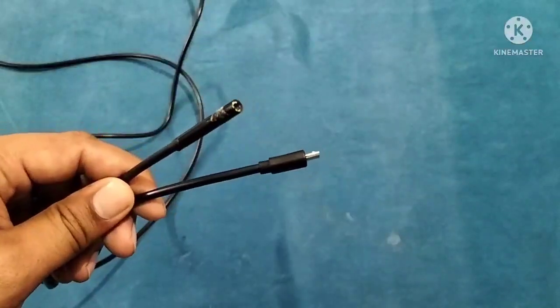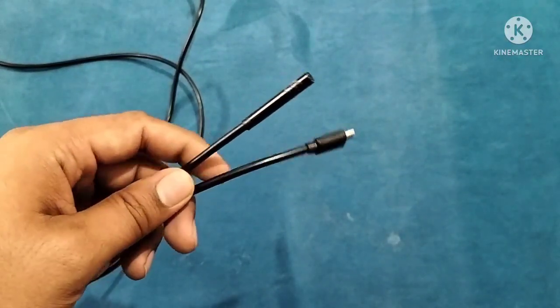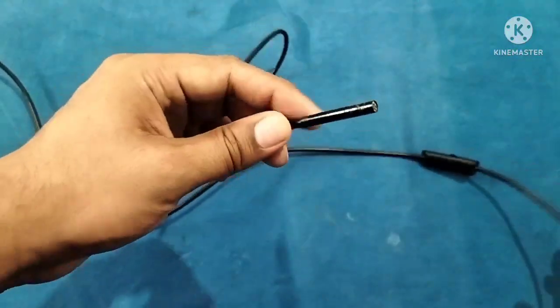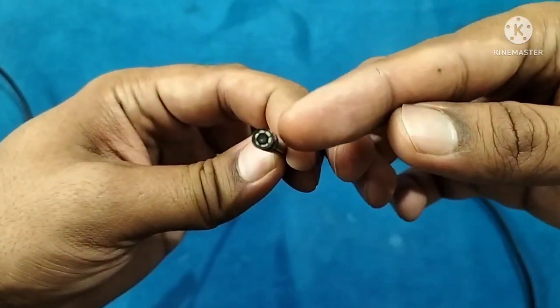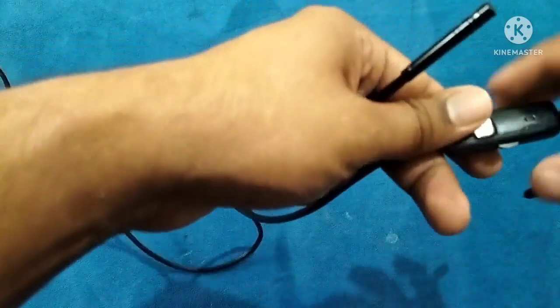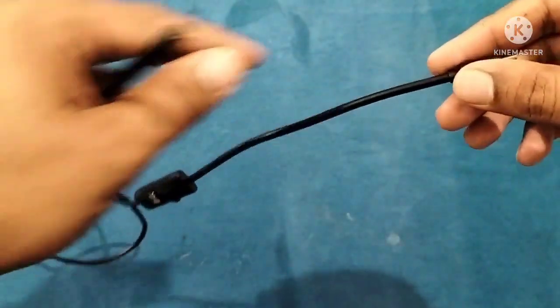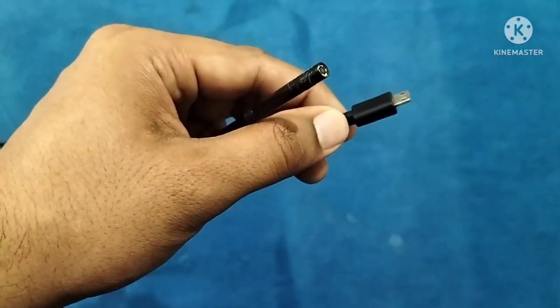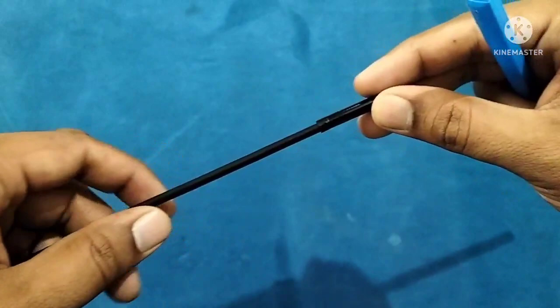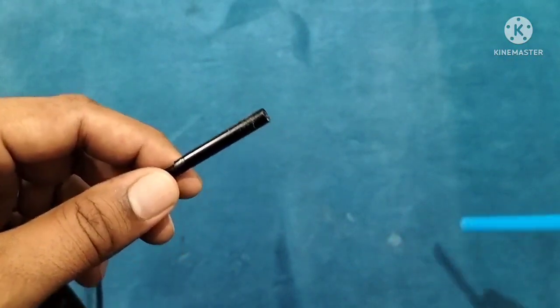This is a snake camera or endoscope camera which is available on Amazon. It can be used with Android phones. The wire is pretty large, making it easier to use. At one end there is a camera along with a row of LEDs which helps in illuminating the dark chambers of the box. There is an LED regulator which regulates the intensity of light, and the other end is connected to the mobile. The arthroscope used in arthroscopy comes under the category of rigid scope, but the camera we are using here is a flexible scope.